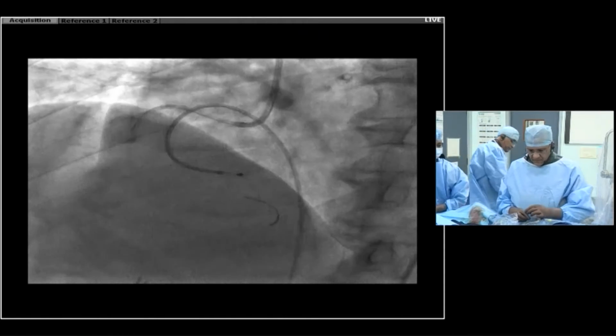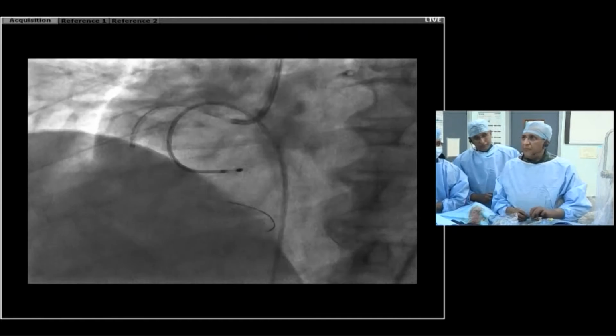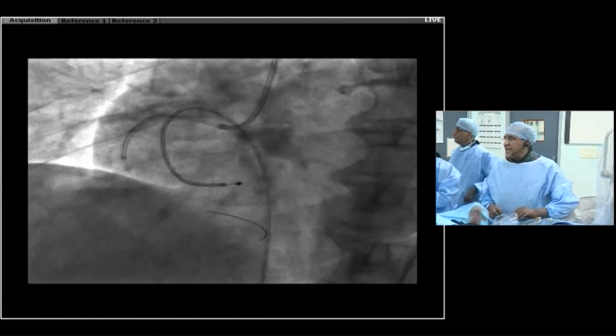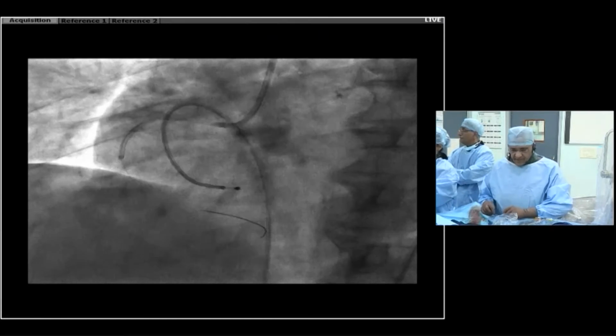I think now that it is open, Kirti, we'll come back and show you what is my final result after stenting. Yeah, do that a few times. Give me a 28. Can you connect Dr. Suhas Center, please? Yeah, sure.